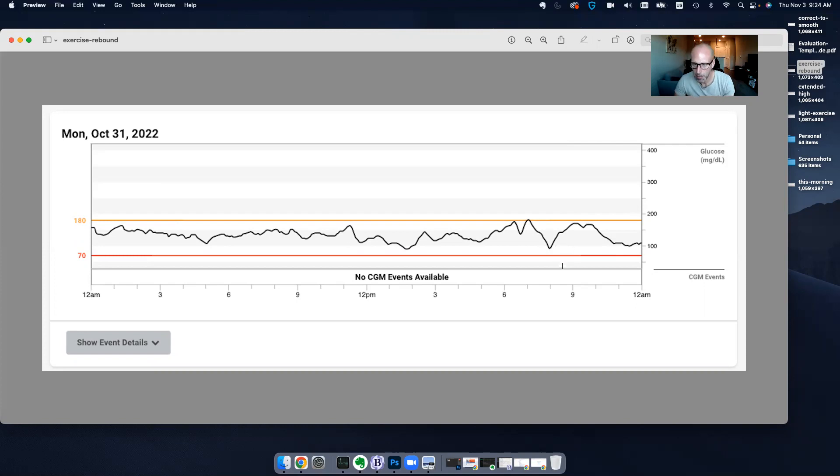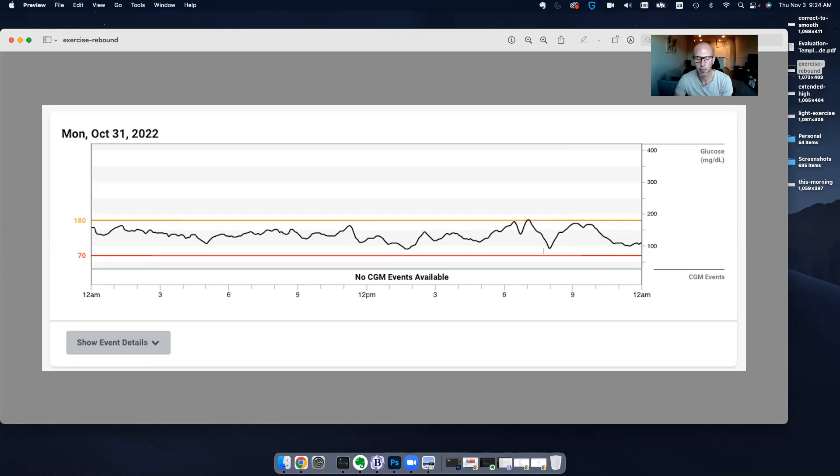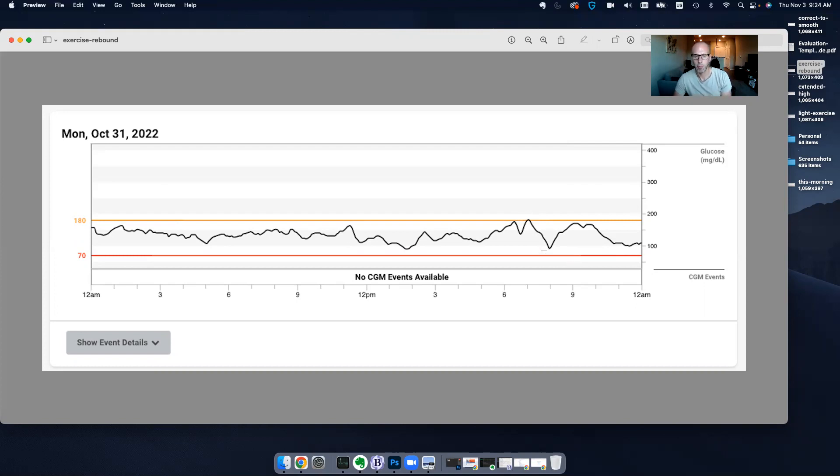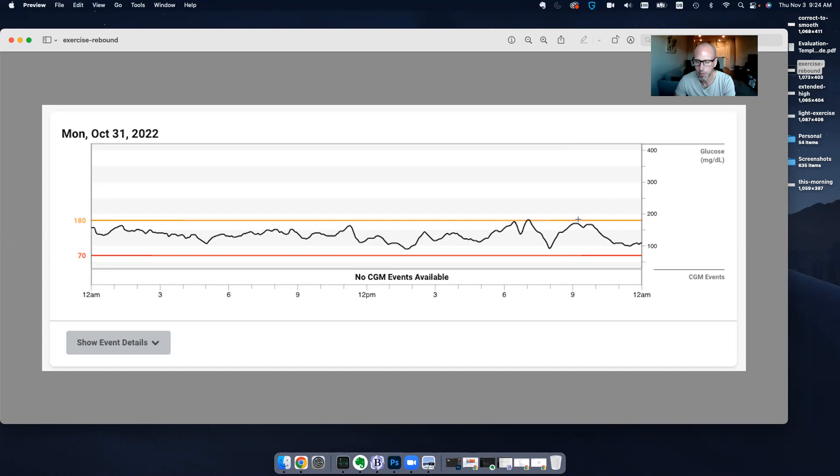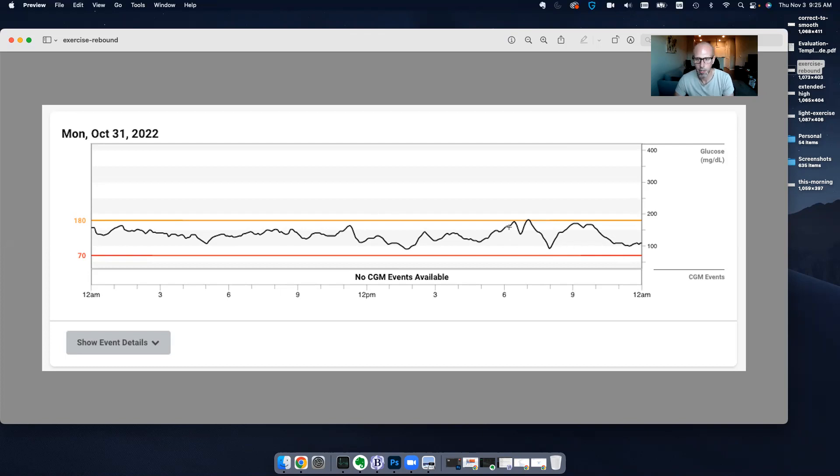The reason that it came up is that when it was coming down so fast, the Omnipod saw that the blood sugar was dropping so quickly and it totally got rid of those background basal doses that I would normally have to keep me stable. So not only was I depleting the sugar from the exercise, but then I was also not getting insulin from the system. And so when I actually came to rest, I jumped way back up. And so you can kind of ping pong here if you're not managing that correctly. So this is an example of very intense exercise and then rest, and then the blood sugar kind of spiking back up. So this is not ideal either, but it does demonstrate how blood sugar can come down from exercise.